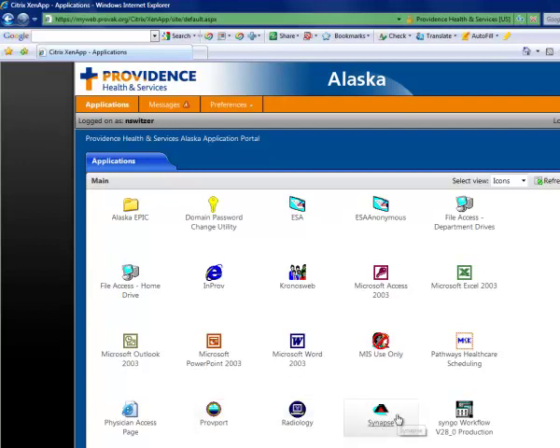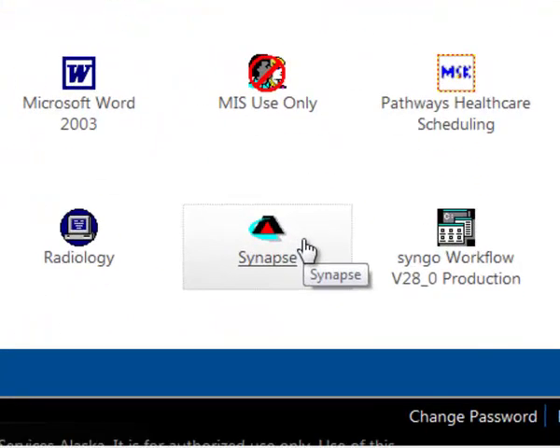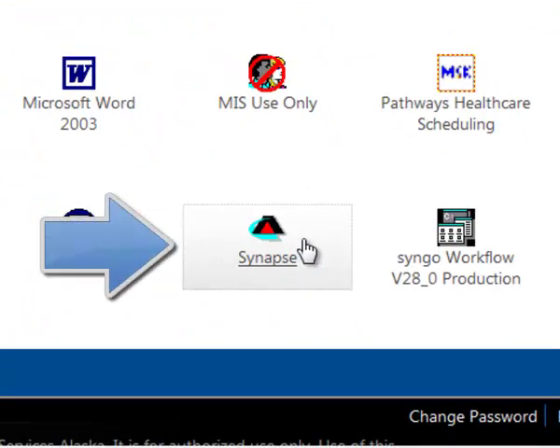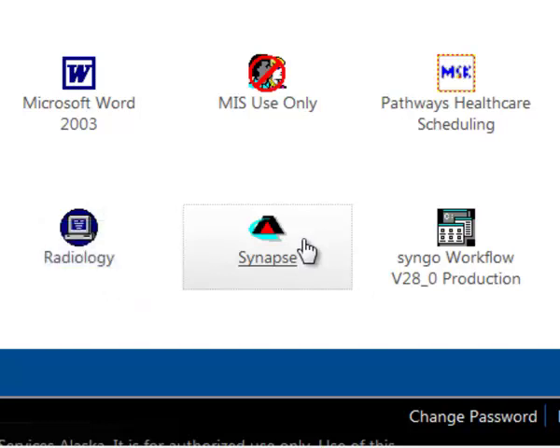Synapse does not require an additional login process and it can stay active on your computer all day long. This is what the Synapse icon looks like if it is present on your desktop. If it is not, stop here and contact Nathan Switzer at Providence Imaging Center who will ask the Providence MIS department to make it available to you. If you need to look at actual images you will definitely want this direct Synapse access.